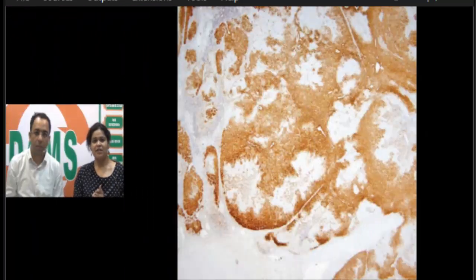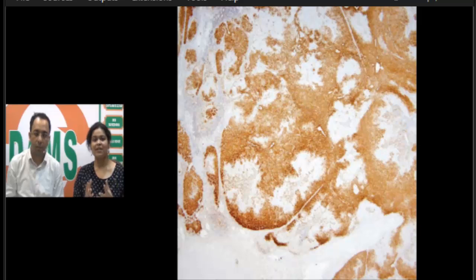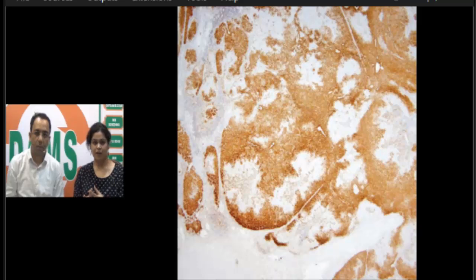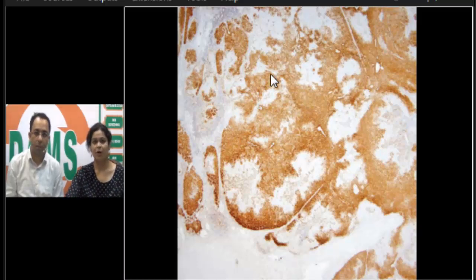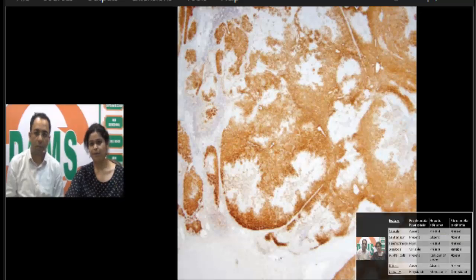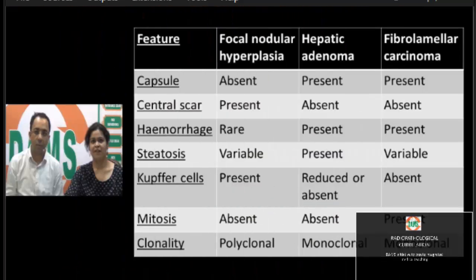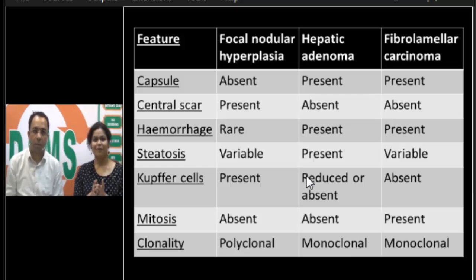On IHC, we perform a glutamine synthetase stain, which normally shows focal staining in zone 3 hepatocytes in a normal liver. In FNH, however, we see characteristic map-like areas of staining on IHC. This is summarized alongside the three important differential diagnoses.